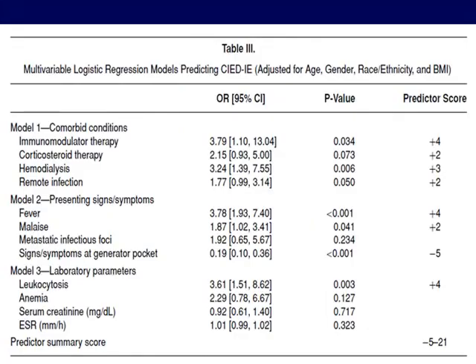One of the things that predict whether they're going to get an infection is all the things that you might expect. If you have immune deficiency or steroid therapy or dialysis, or you've had infections in the past, certainly if you have a fever, malaise, whatever, all those things make it really more likely that you can have an infected device.